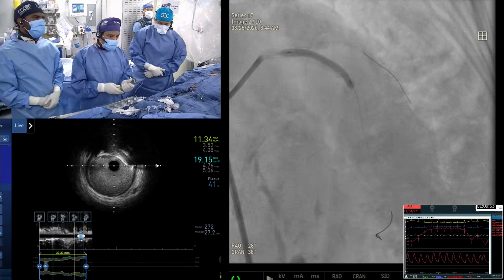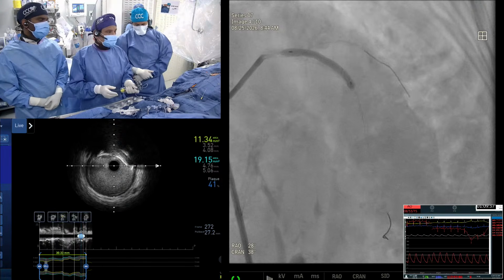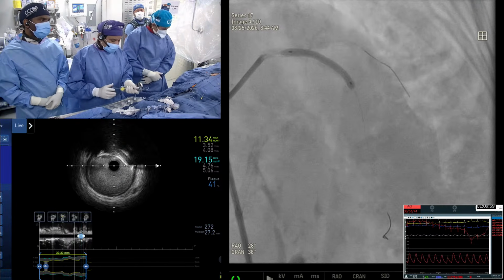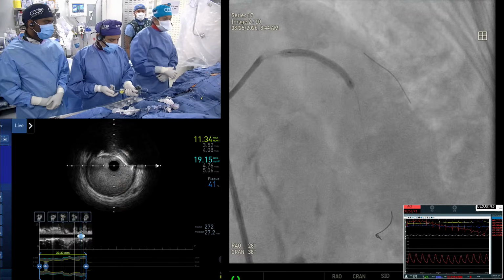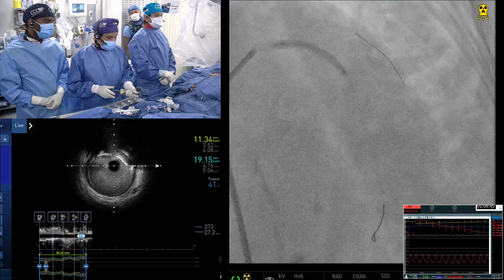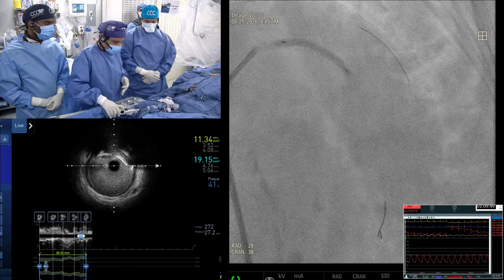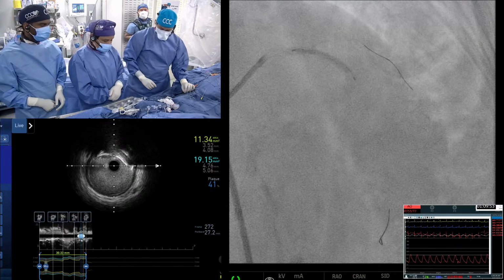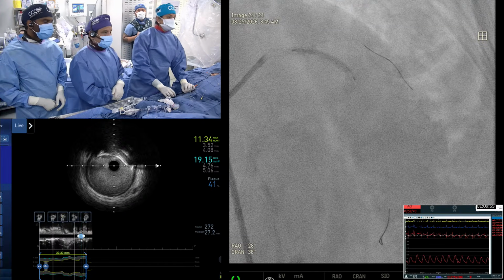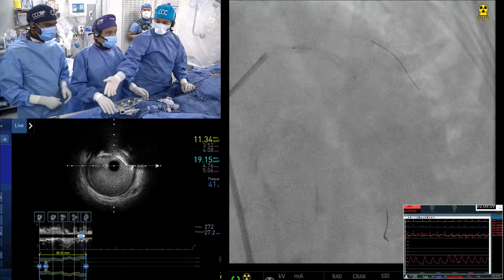And I see that a lot of people just go up and down. No, you have to let the pressure transmit to the stent balloon. What they do is maintain it at 10. Oscillation does not work. Yes, so now you left it at 10. If your pressure does not go down, it means you are fully inflated, and then go negative. We actually did the oscillation trial with a balloon called crack, and the oscillation did not work.